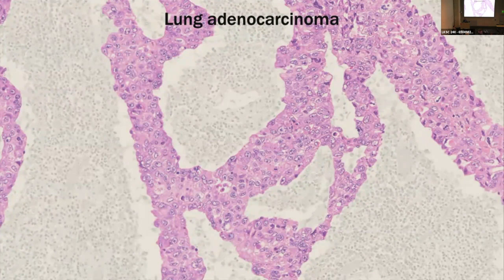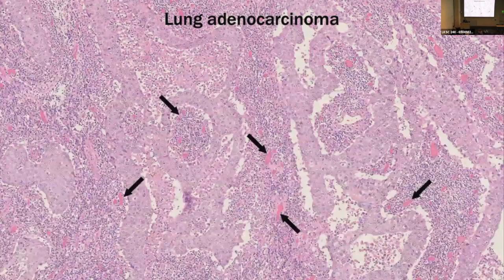And then the cellular composition is also abnormal because it's all one cell type, like where did the vessels go? And so we can go back here. And it almost looks like the vessels are within the alveoli and forming these little clusters. So that's an abnormal architecture.